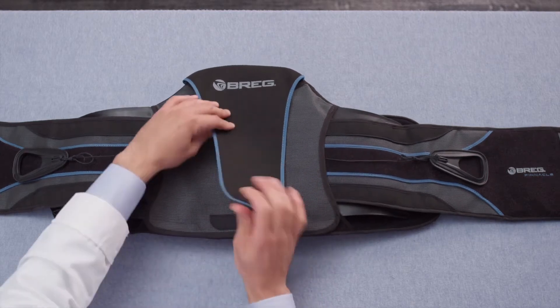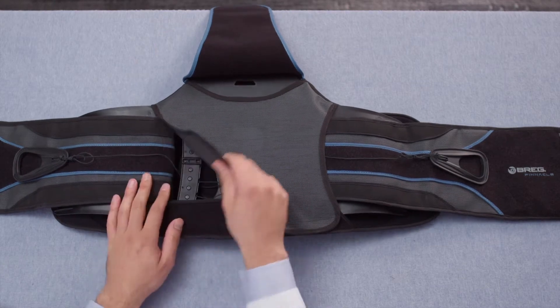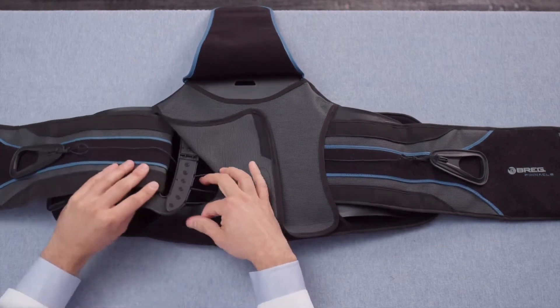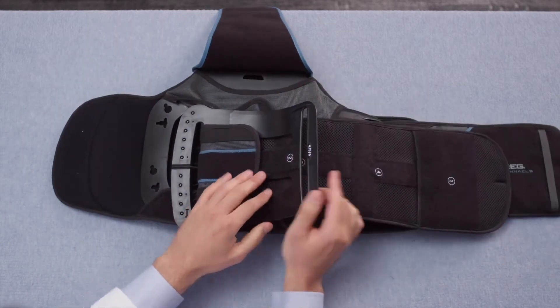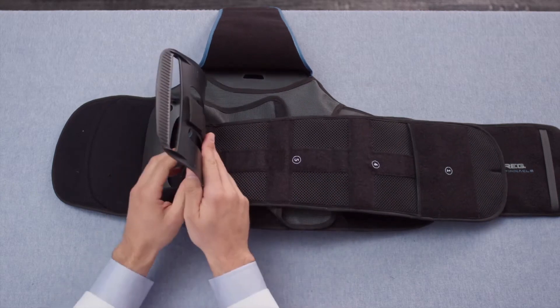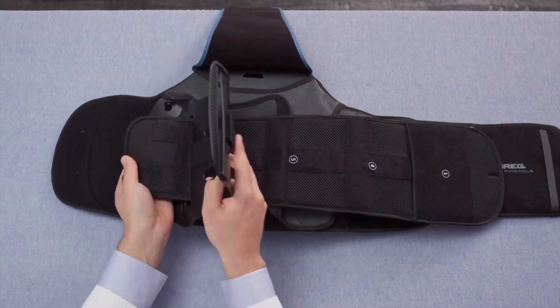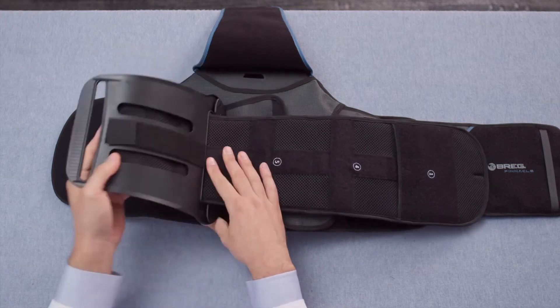Start by folding the hood out of the way, then lift one corner of the back cover. Flip the belt panel upside down. Now you're able to see the various size indicators on the central strip of the belt panel. Separate the plastic piece from the belt panel and move the edge of the waist belt to match the appropriate size number and reattach.